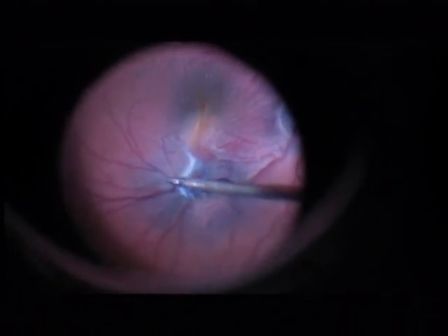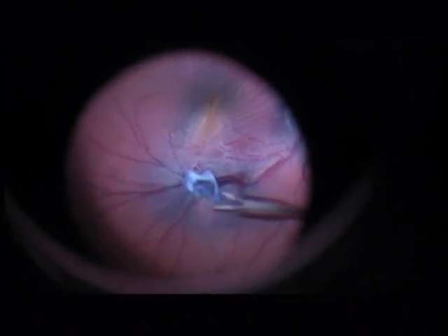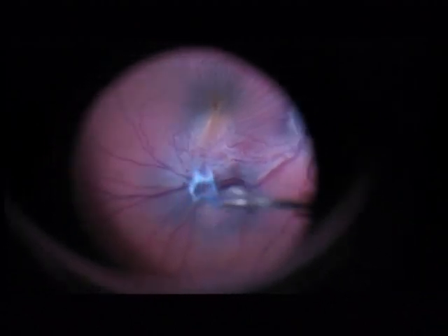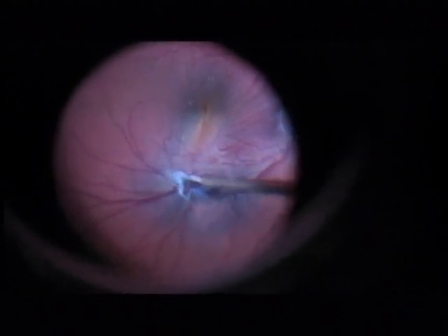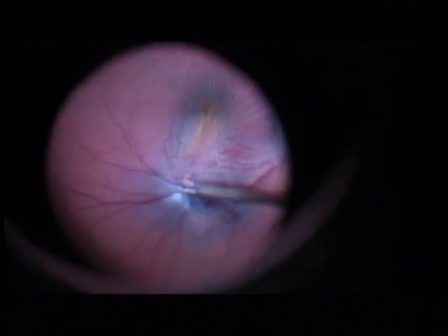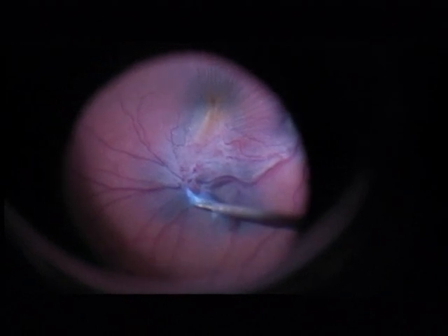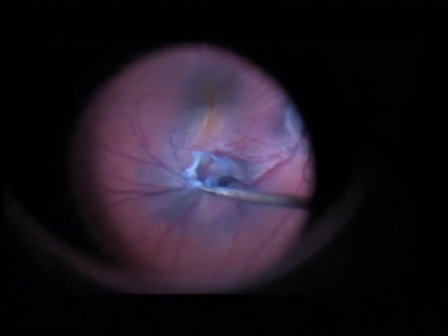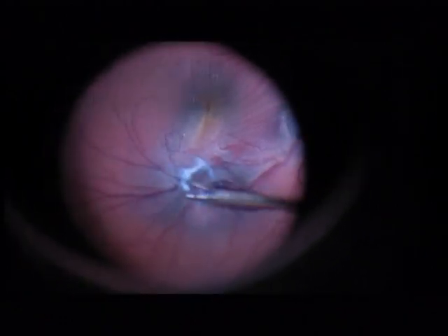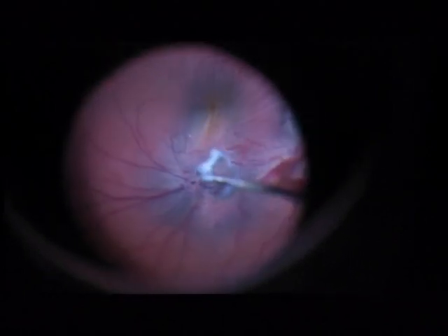Now you have to be careful again because we are going over the big vessel. I don't want to injure the big vessel when removing this thick membrane. There it is — the membrane is removed.